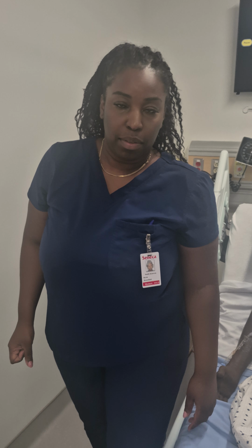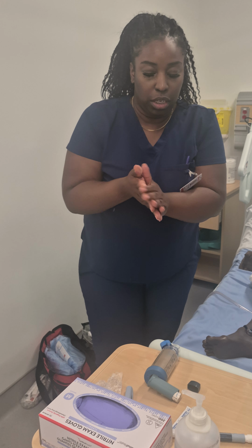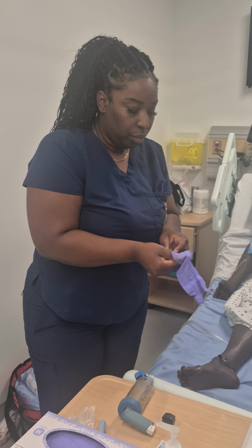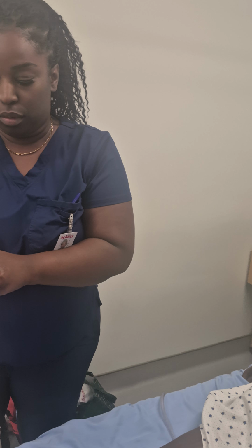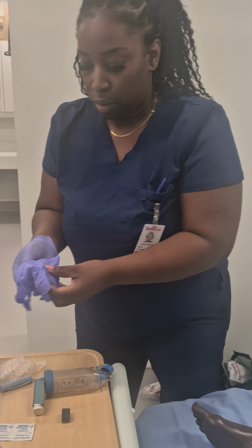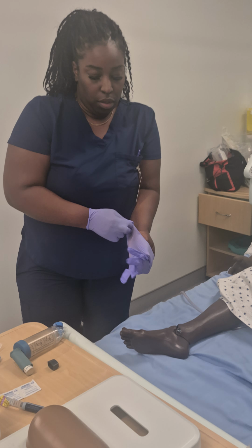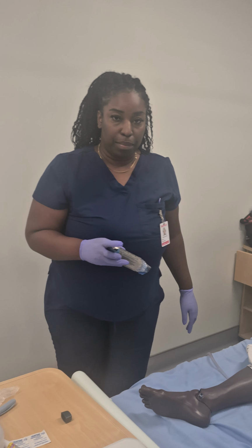Okay, hi, my name is Nicole Broomfield. I'm going to be the student nurse today, administering medication. I'm going to do hand hygiene. I'm going to don gloves. So Mr. Smith is requiring, not insulin, Ventolin because of shortness of breath.